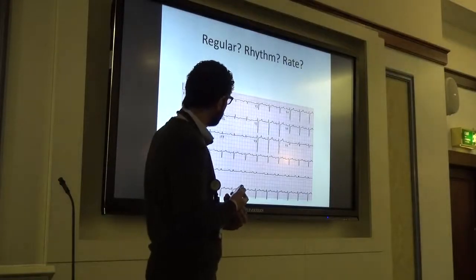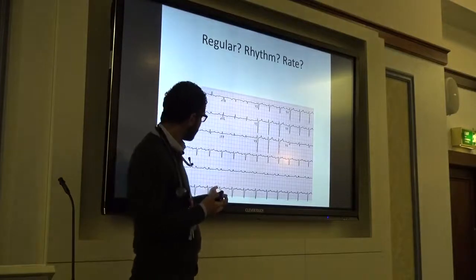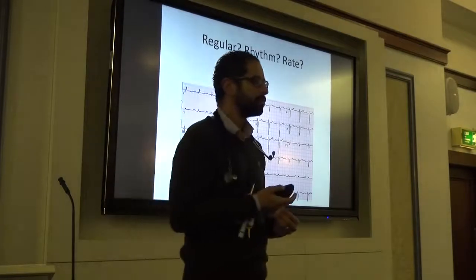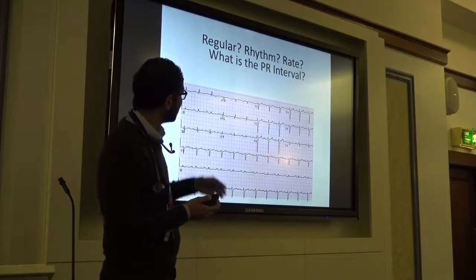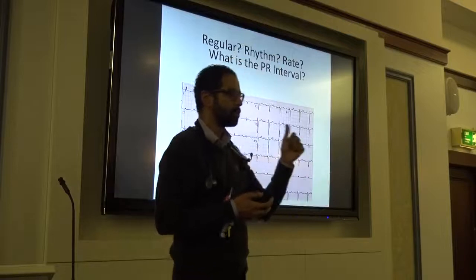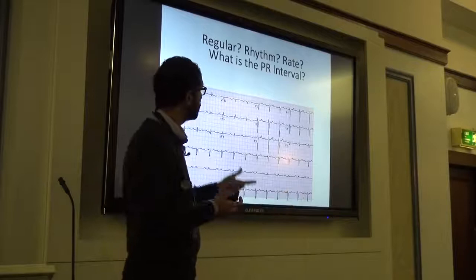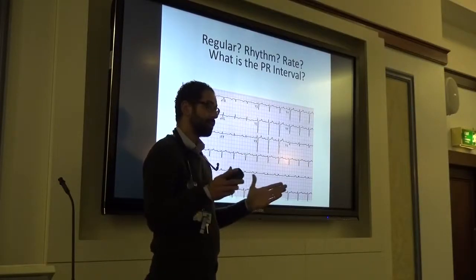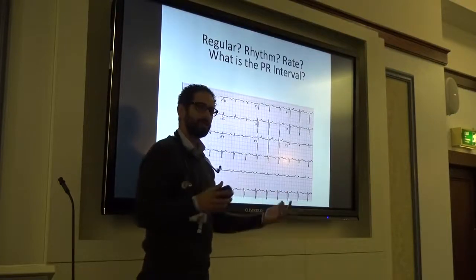It's not bradycardia. But when you look at an ECG and you're looking at the P wave, are you noticing anything between the P wave and the QRS? Prolonged PR, alright? So when you start seeing an ECG, just try and incorporate this question into your mind quickly. I'm going to ask, is it regular or not? What's the rhythm here? I'm going to ask about the rate, and then just like we did with the QRS last time, I'm asking, is there a bundle branch block or not? Just ask yourself, is it grossly abnormal, and keep an eye on this.